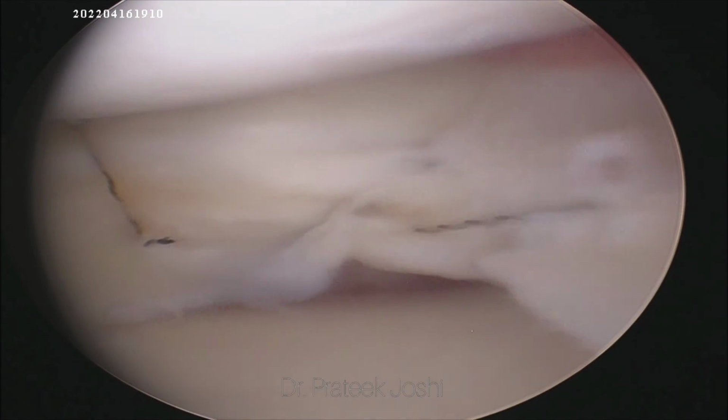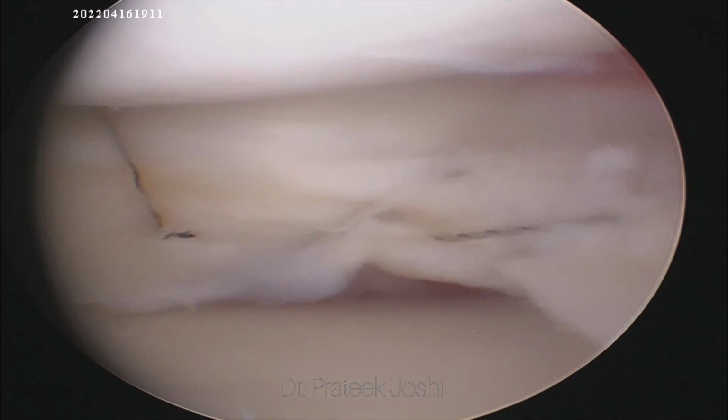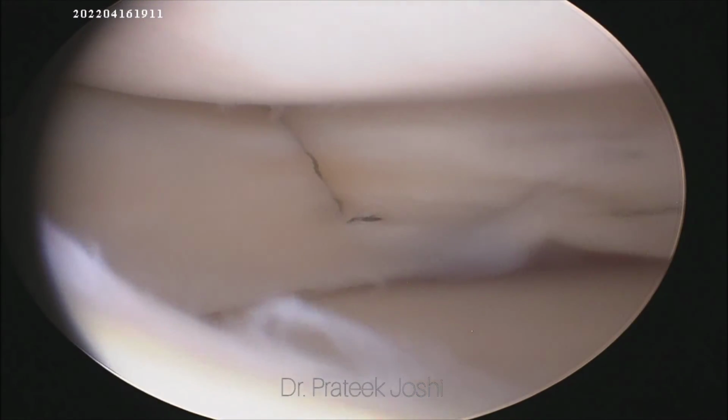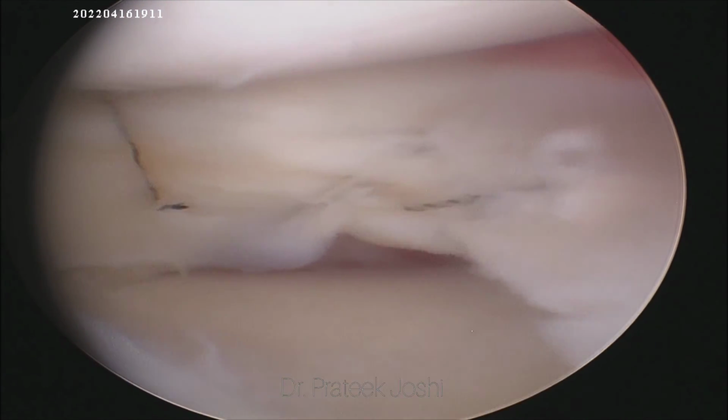As you can see, there are two vertical mattress all inside sutures and one horizontal mattress suture taken by outside in technique. This completes the procedure.